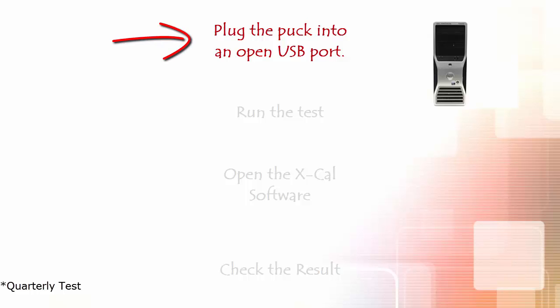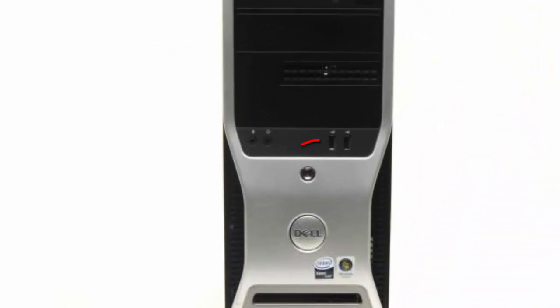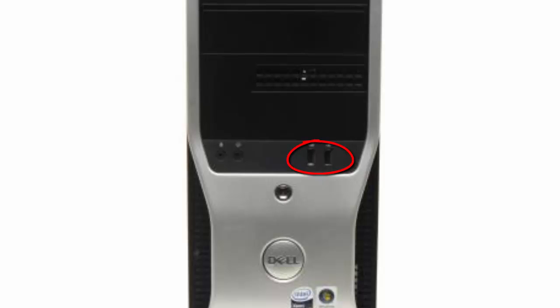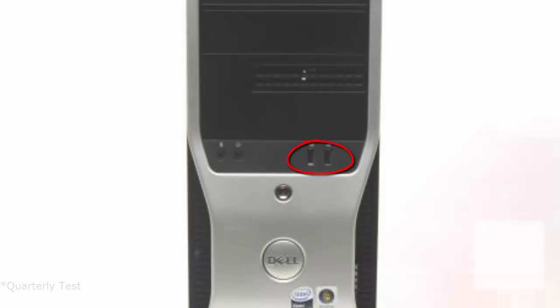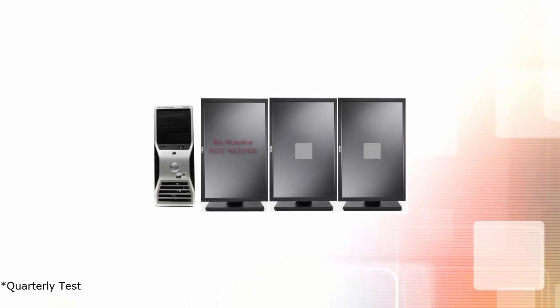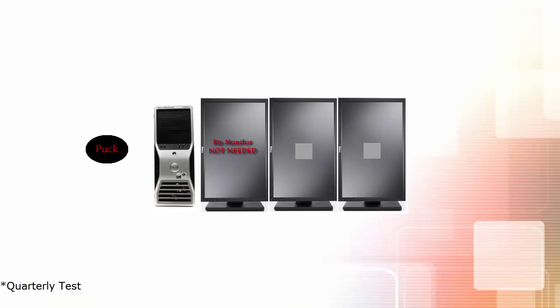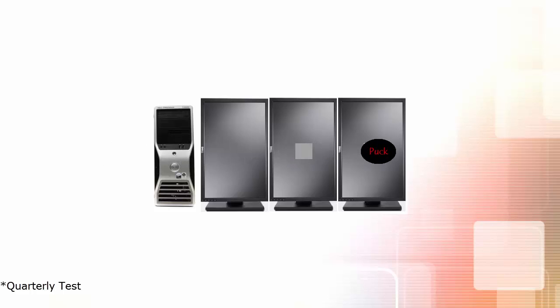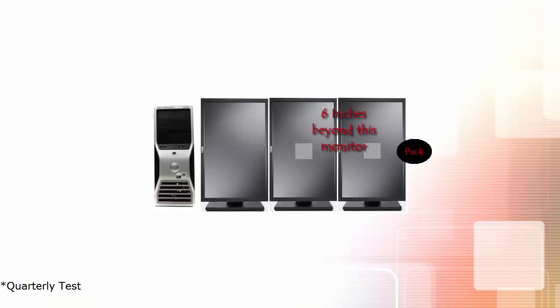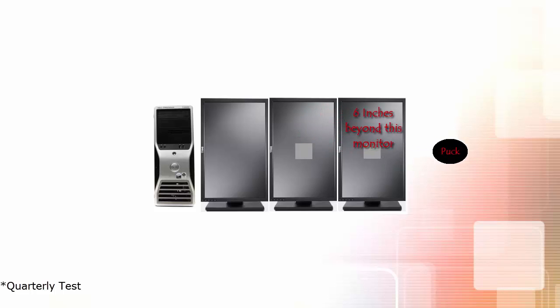First, locate your puck and plug it into the USB port in the front of the computer. We must make sure that the puck is able to reach your imaging monitors. With puck in hand, stretch the puck out six inches past the edge of each monitor to be tested. If the puck will not reach, the next segment explains a workaround to this issue.